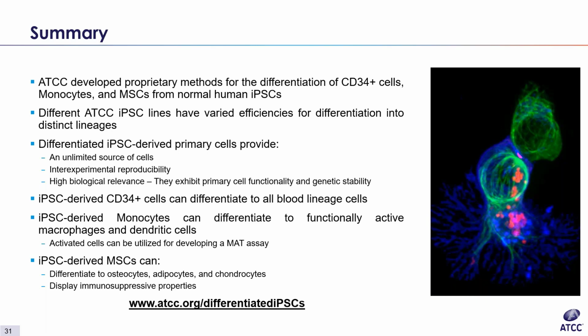So it looked like we tested the MSC differentiation capacity of 4 different iPSCs. The part numbers were ACS-1019, which is foreskin fibroblast derived, ACS-1026, 1031, and 1030, which were all bone marrow derived, each from different ethnic groups.